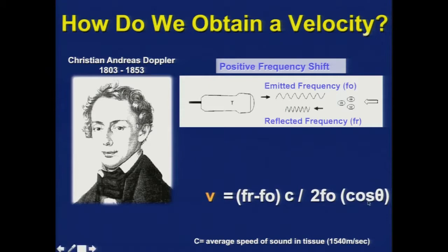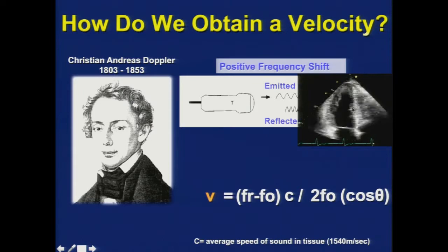Remember that in the denominator of the equation is the cosine of theta, and we heard in the first lecture this morning, of course, that the cosine of 90 degrees is 0, and the cosine of 0 is 1. So it's important to stay as parallel as possible to the intercept axis of motion or flow, depending on what you're looking at, so as not to underestimate the velocities. Now, we generally think about this in terms of looking at blood pool Doppler, spectral and color Doppler. But in myocardial imaging, of course, we're not looking at the blood cell. We're trying to look at the velocities of the muscle.